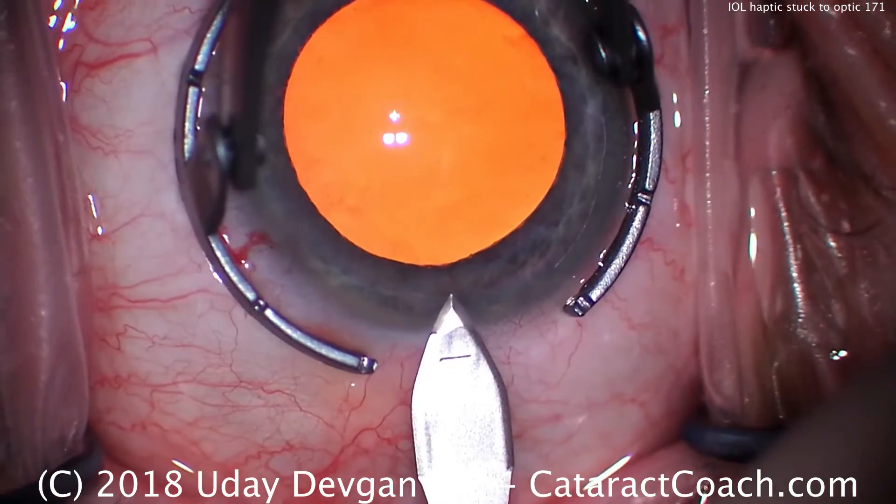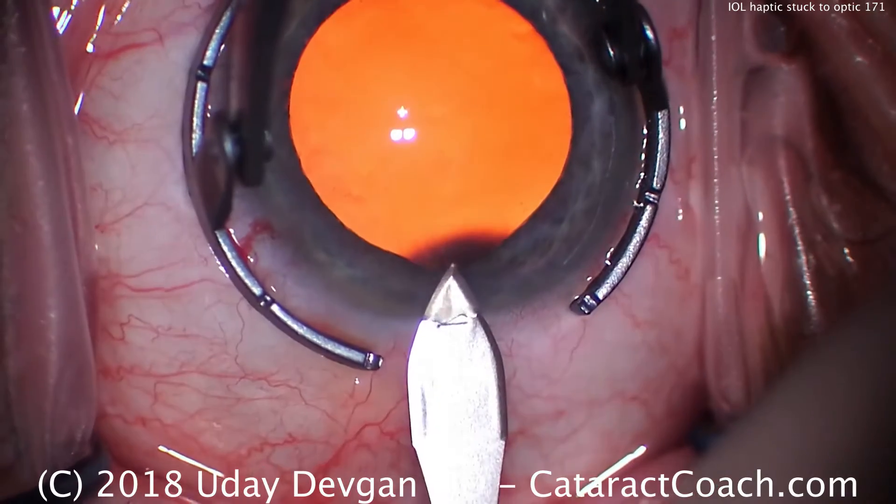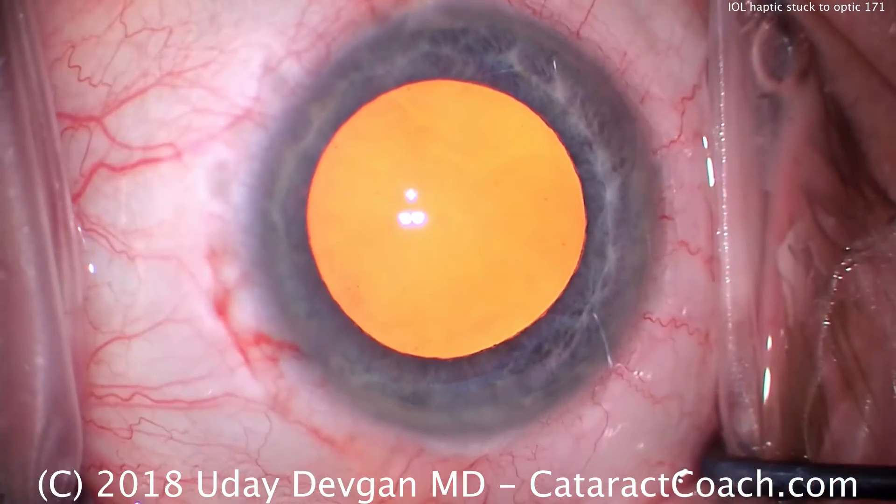Here's our phaco incision, temporally, single plane, nice tunnel length made with a steel keratome.